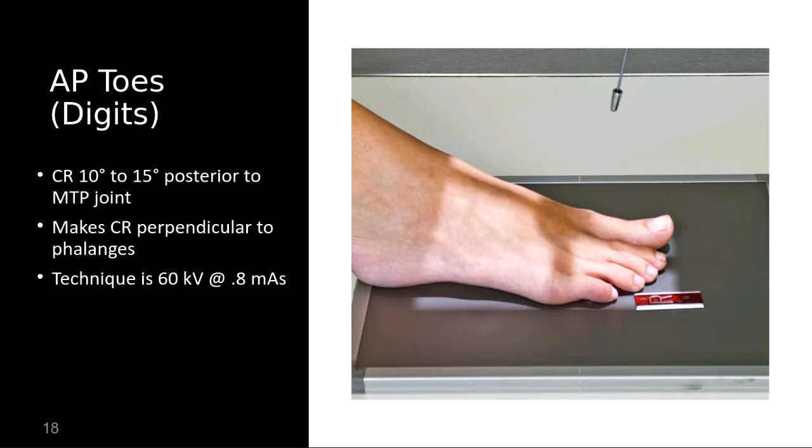And the marker placement on here is not correct because it would hang toes up. So what you would actually want to see is that marker, and then you would want the right to read properly. So opposite of what it is right here.